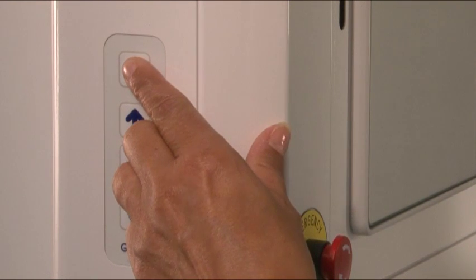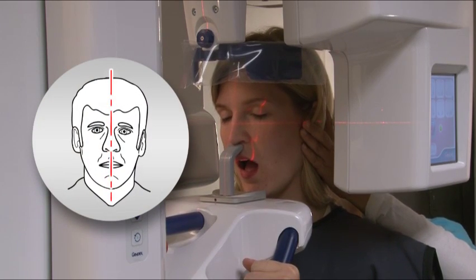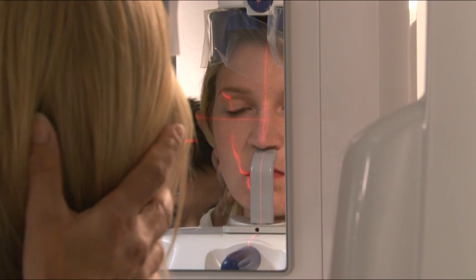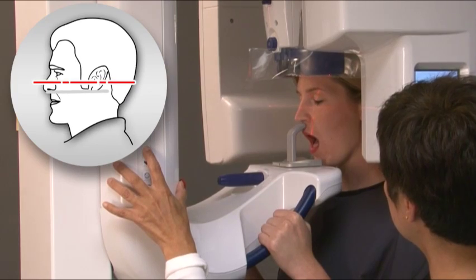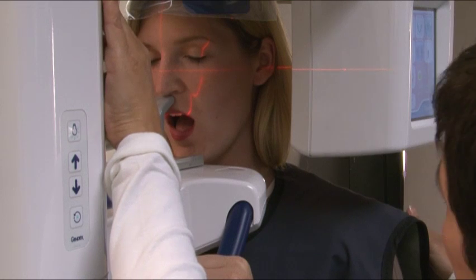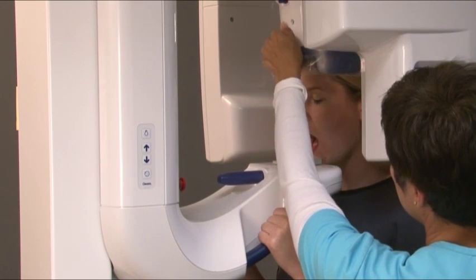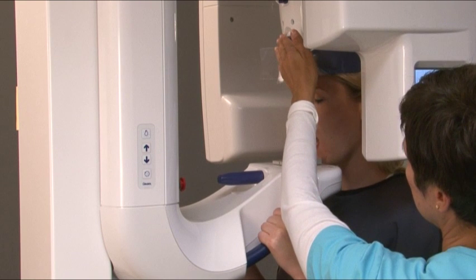Press the laser button to initiate laser alignment lights. For mid-sagittal placement, verify that the patient's head is not tilted or turned to one side. Laser adjustments are made for closed positions as well. For TMJ horizontal placement, use the up and down buttons to bring the patient's Frankfurt plane parallel to the laser. If desired, laser lights can be raised or lowered before making adjustments to the Frankfurt plane. Carefully push the head support towards the patient and rotate the head support knob clockwise to close the temple supports so that they gently but firmly grip the patient's head.